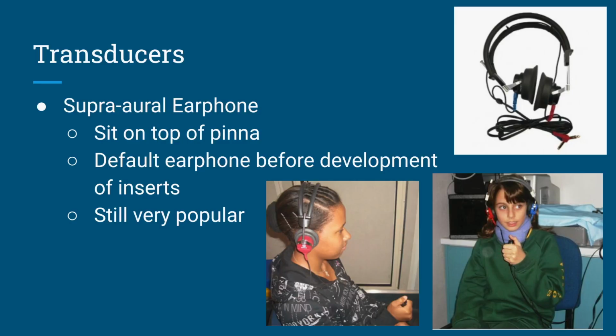and either not centered adequately on the patient's ear or causing collapsing canals may result in erroneous hearing thresholds that are higher than they should be. Slightly higher output than inserts is the benefit. It should be used with patients who have active drainage, profound hearing loss, or atresia. So when I say atresia, I mean ear canals that are not present.